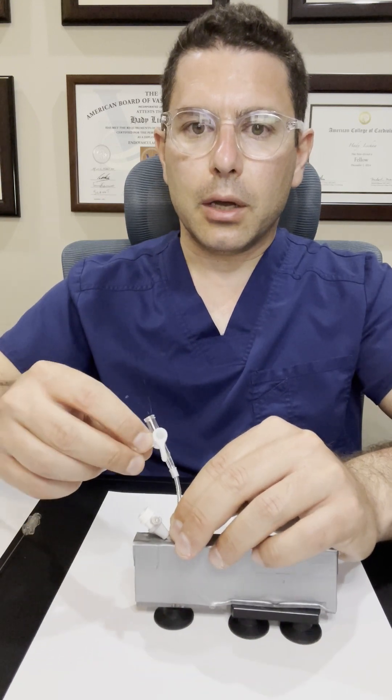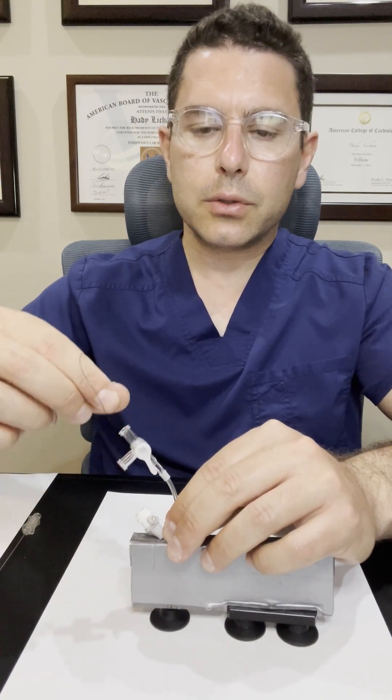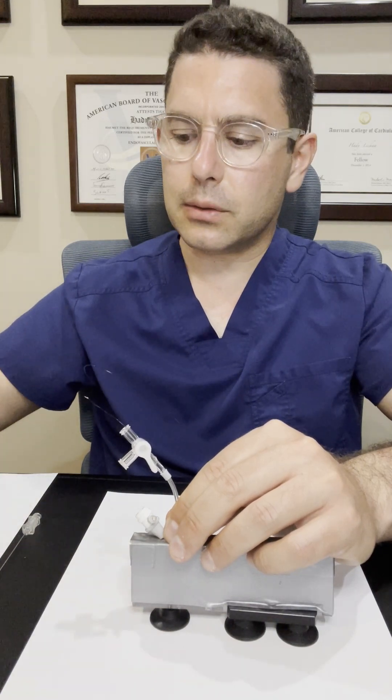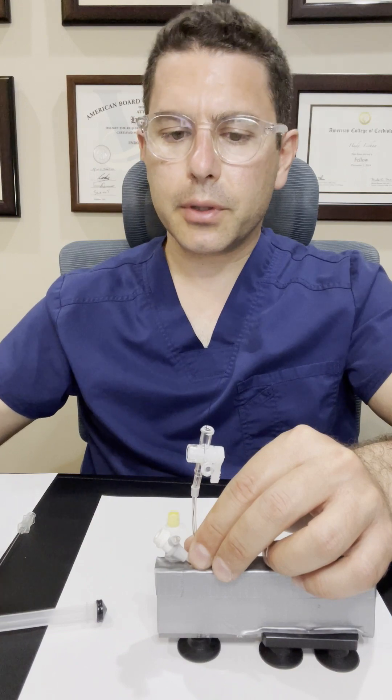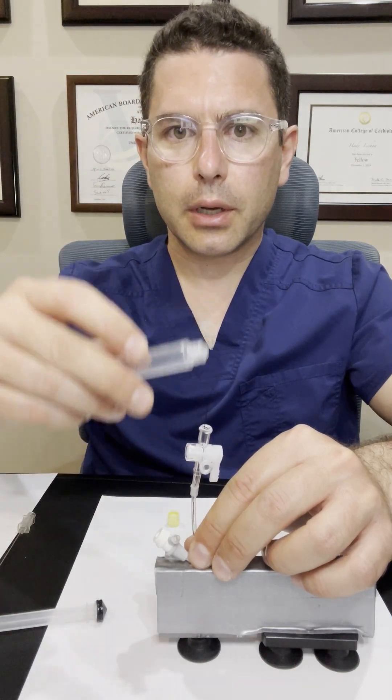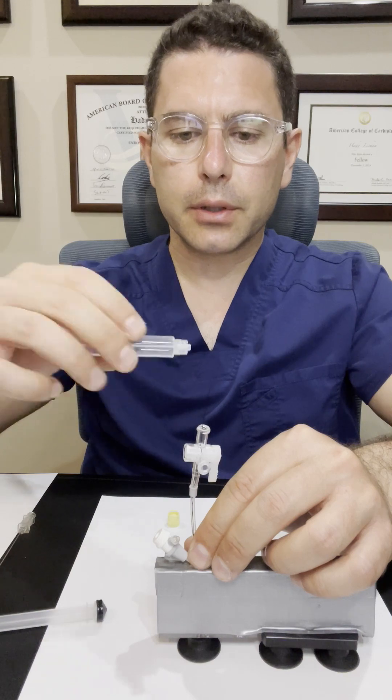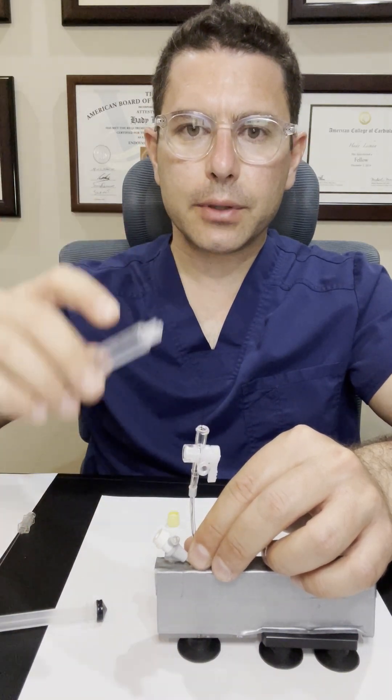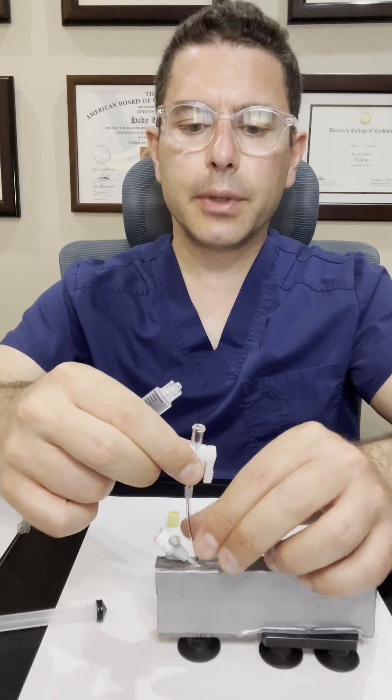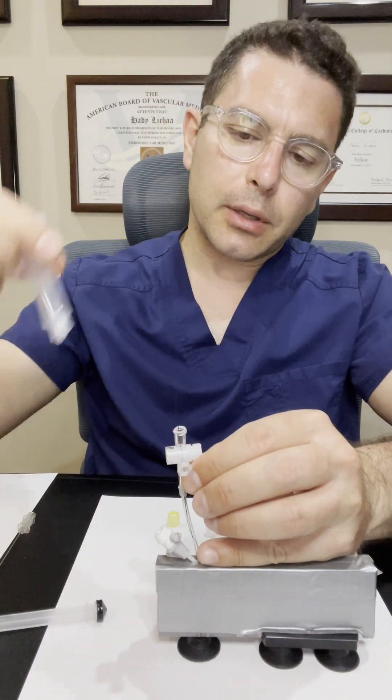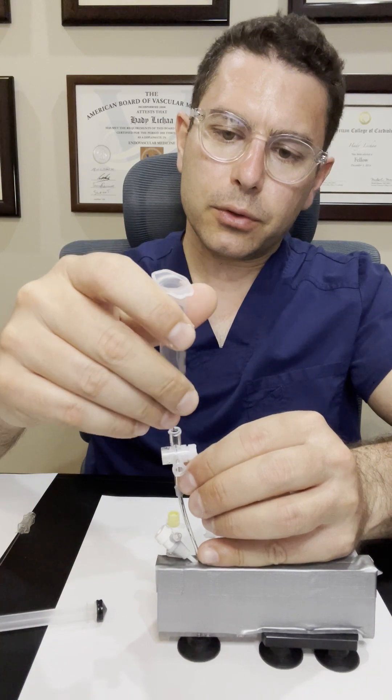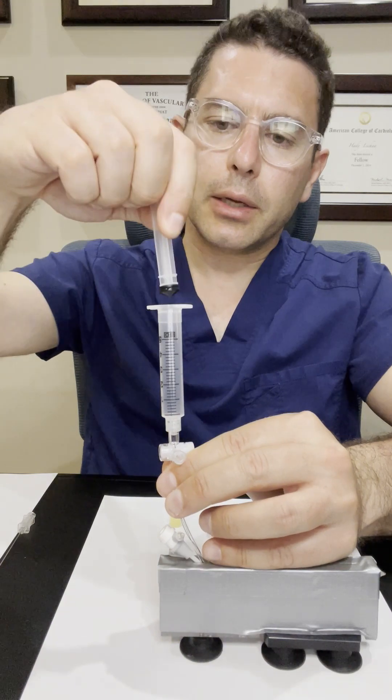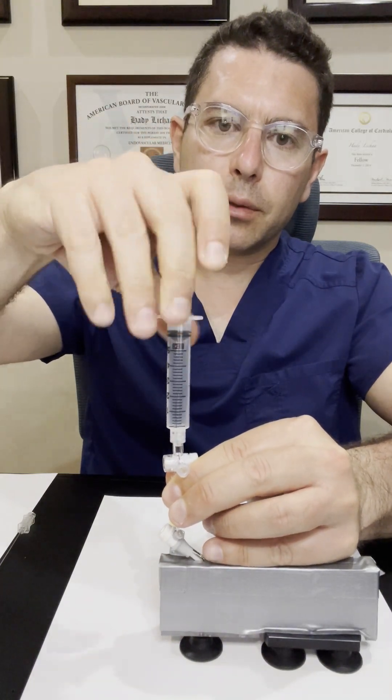At this point, obviously the sutures are exiting the side port. We're going to have to cover those to maintain sterility. In order to cover the outside portion of the suture hanging out of the side port, we're going to be taking a three or five cc syringe. We'll remove the plunger and basically thread that suture inside the syringe. We're going to lock it on the lower lock.